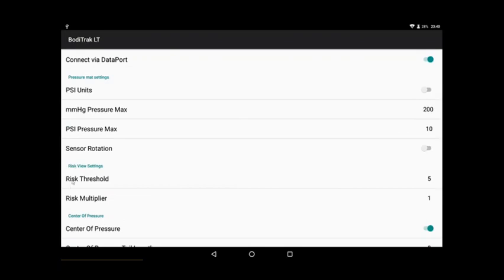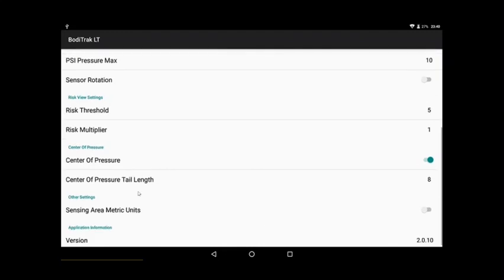Here's risk threshold. That's the Reswick Rogers curve. Anything over five millimeters will start to show on the screen. I've set that multiplier back to one, which is normal. Center pressure is a little circle on the screen that represents their center pressure on the cushion, and the length of that black tail. You can make it longer if you like.